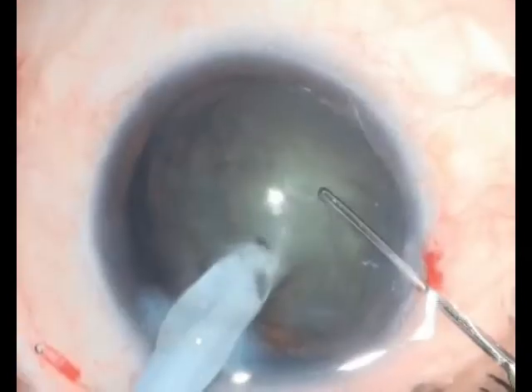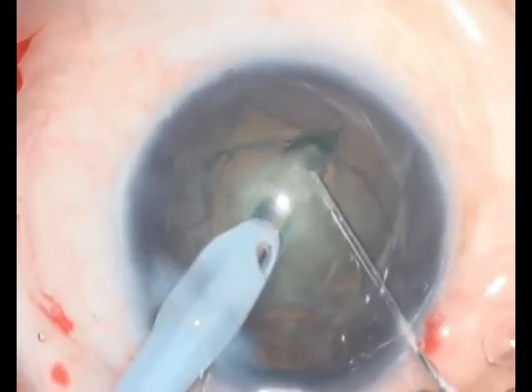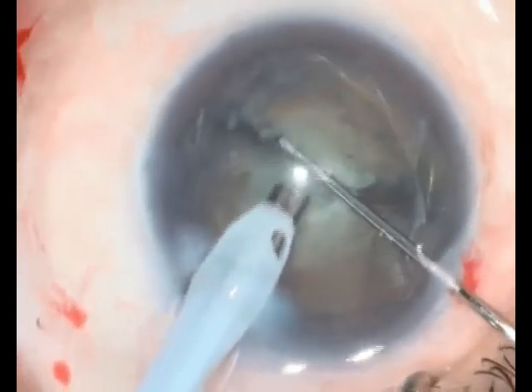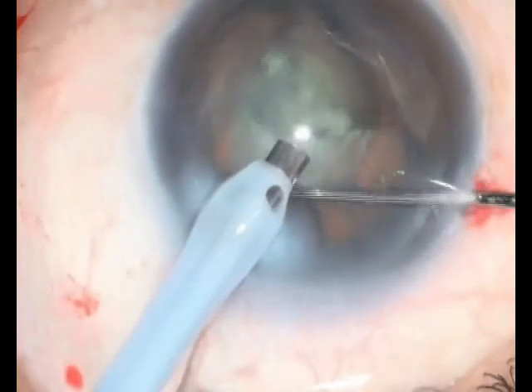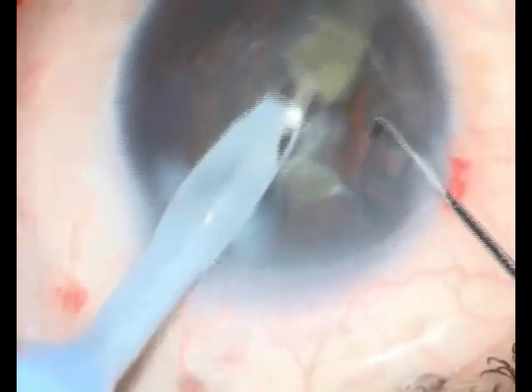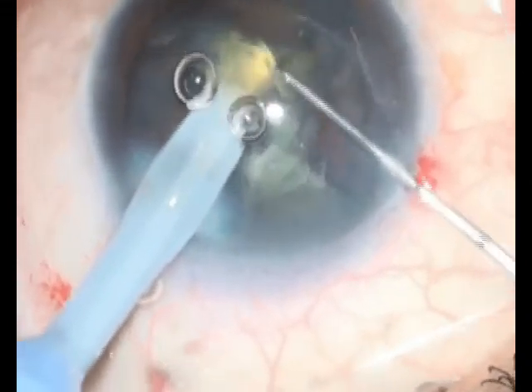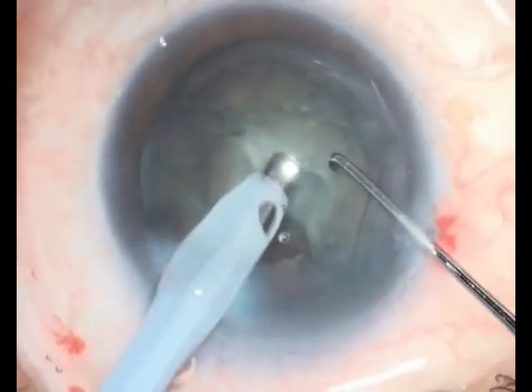And finally, when faced with a nucleus which is soft yet has a significant nucleus, the technique of choice is a direct chop wherein the nucleus is impaled, a chopper is used to divide the nucleus into two equally sized heminuclei, after which turn by turn each heminucleus is further downsized by the technique of direct chop again, and each of these fragments is then emulsified turn by turn.